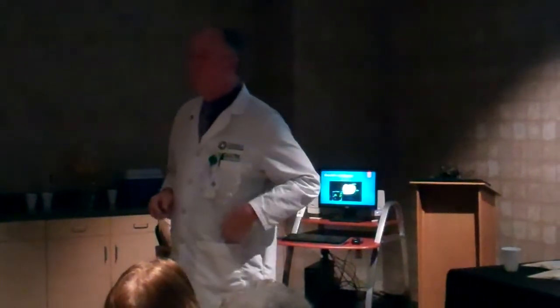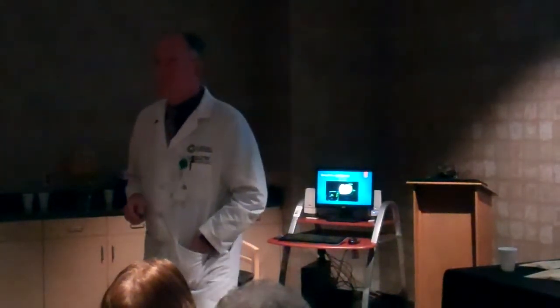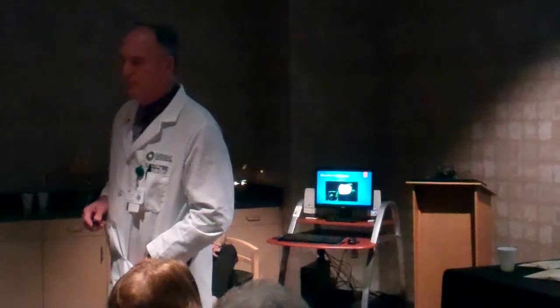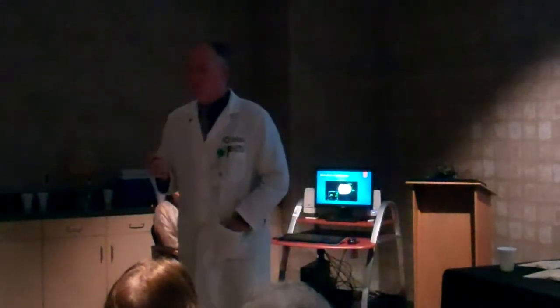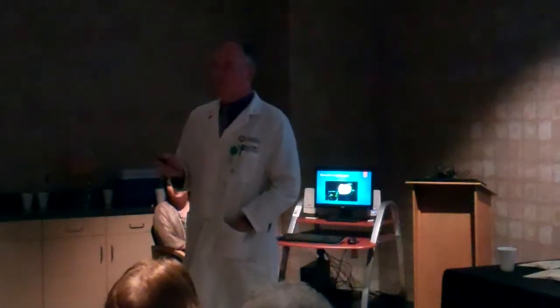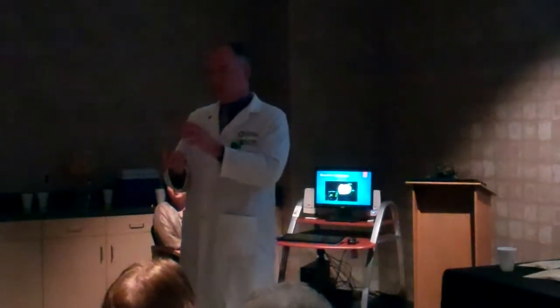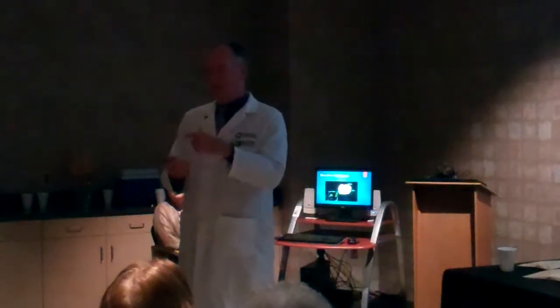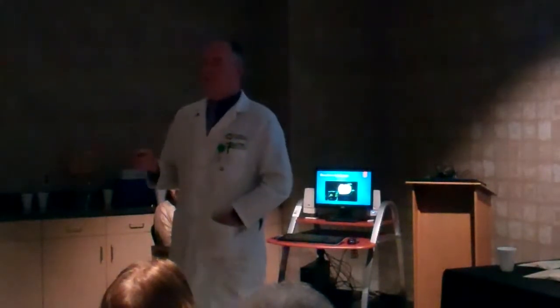And is this done by laser or just whatever you use there? Not by laser. It's mostly small hand instruments, and then this powered instrument called a microdebrider that has a suction. It pulls in, for instance, polyps, and then has rotating teeth that cut it, so it eats it up a little bit at a time.